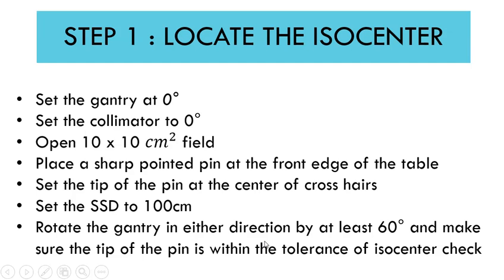Rotate the gantry in either direction by at least 60 degrees and make sure the tip of the pin is within the tolerance of the ISO center check. As you rotate the gantry, the tip of the pin and the center of the crosshair should not deviate beyond the ISO center check tolerance, which is usually a 2 millimeter diameter.